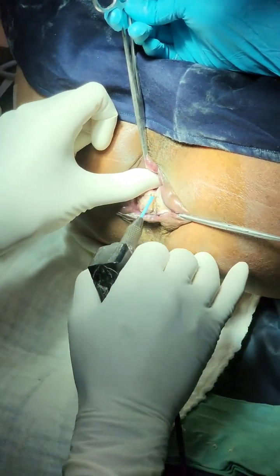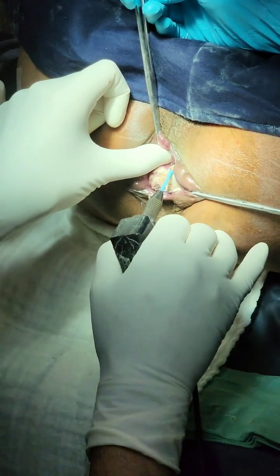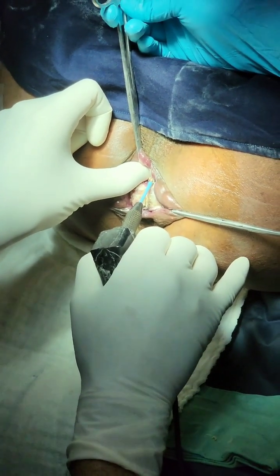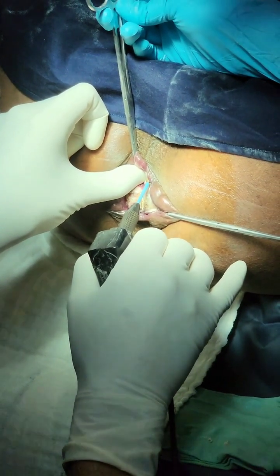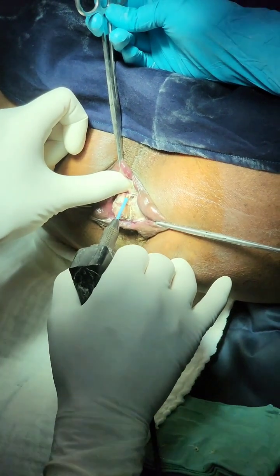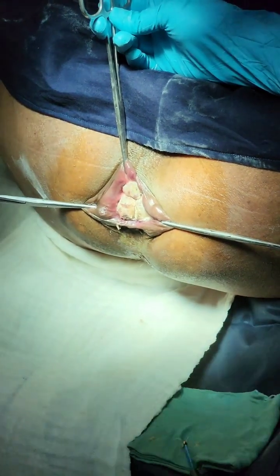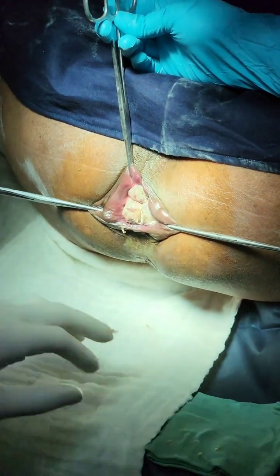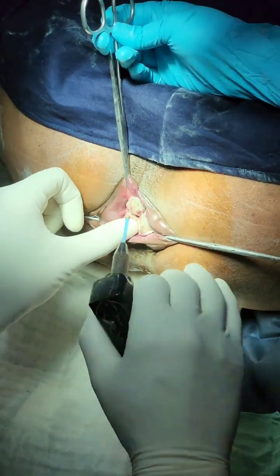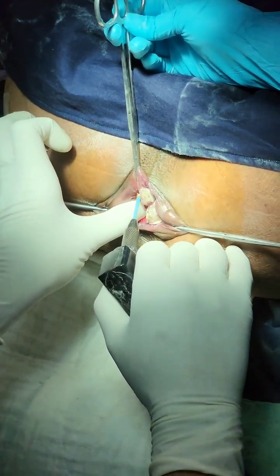Our procedure is a method that would fix the prolapsing hemorrhoid to its normal position while abolishing its vascular components, without resection, thereby minimizing the complications related to excisional procedures.